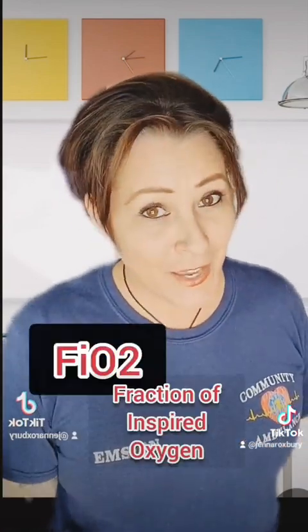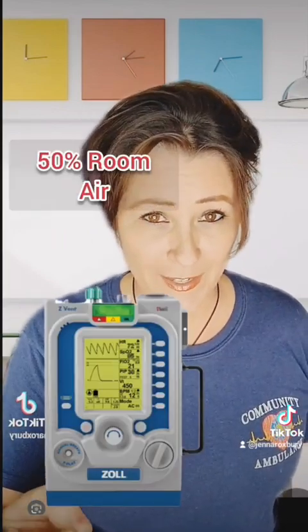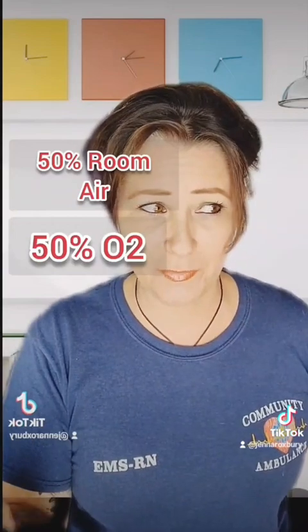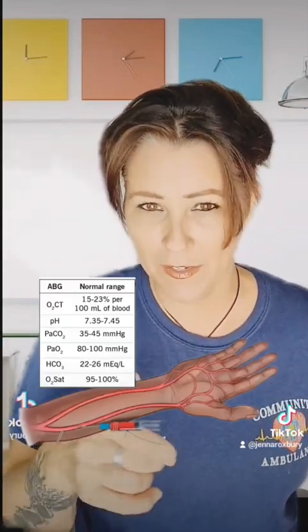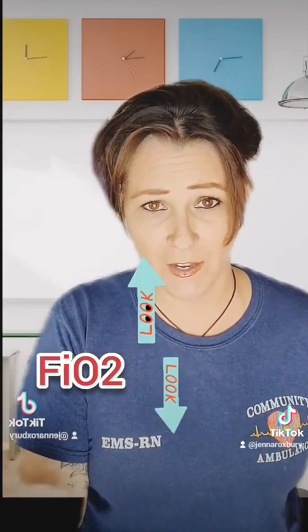Let's move on to the FiO2, the fraction of inspired oxygen. So if you set the vent for 50% FiO2, you're essentially giving half room air, half pure oxygen. In the hospital, they monitor ABGs, so it can tell the respiratory therapist whether they need to turn the FiO2 up or down. Here in the pre-hospital setting though, we've normally RSI'd a patient or they're post-ROSC, and I just crank that right up to 100%. And then just quickly get them to the RT, who's a lot smarter than me.